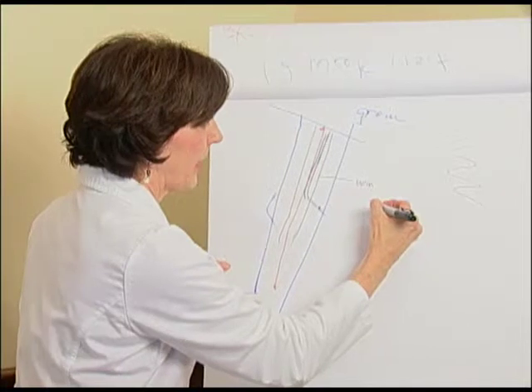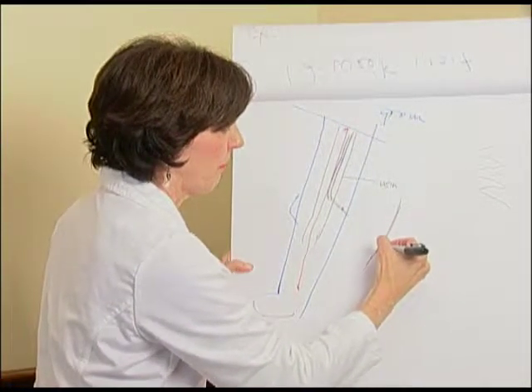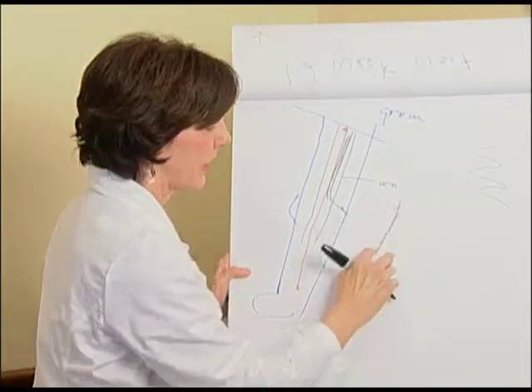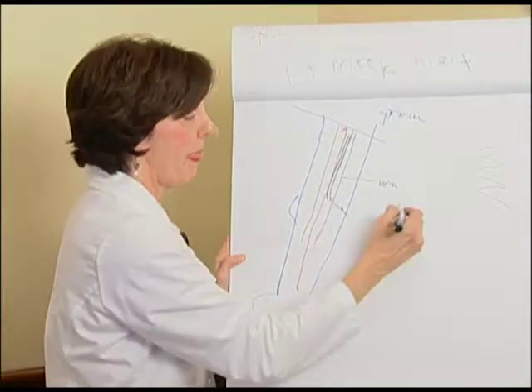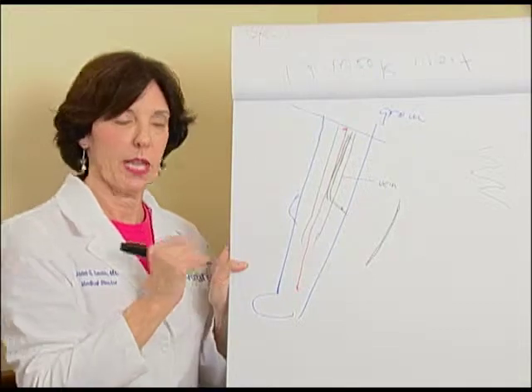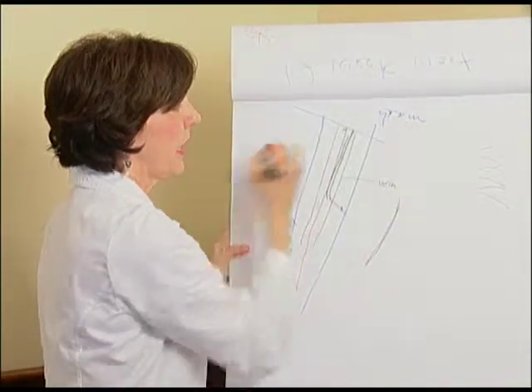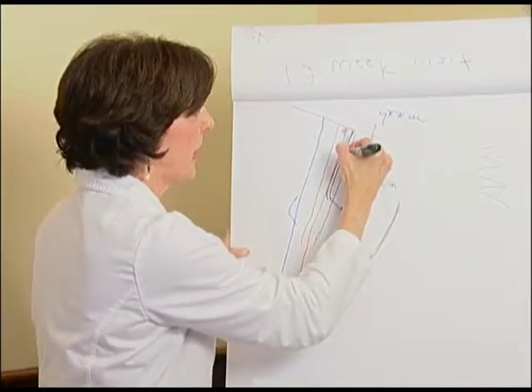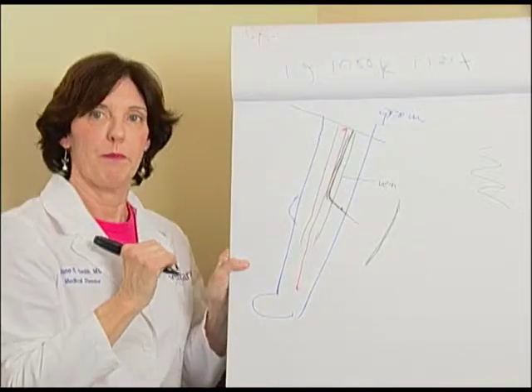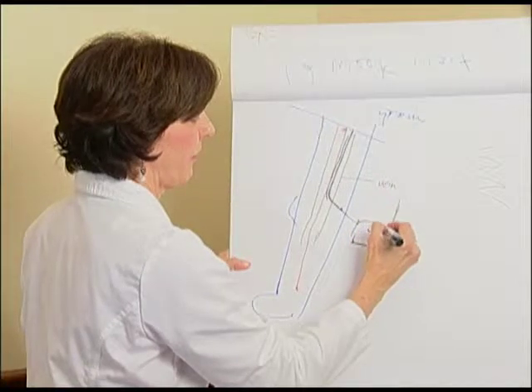So that's attached to, and the fellows here can attest to, what looks like a clear fishing wire. Now it's actually smaller than that. But that allows me to insert the laser into the vein, okay? So when we have you all set, the laser filament is at the top, and then the tubing is basically threaded down through the vein and out, okay? Now this is attached to the laser machine itself.